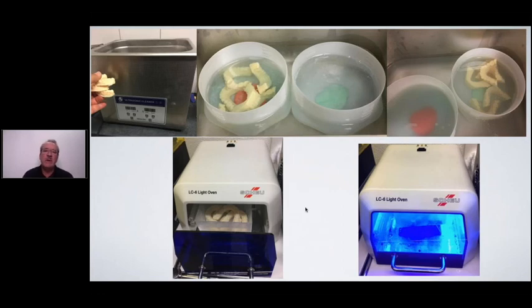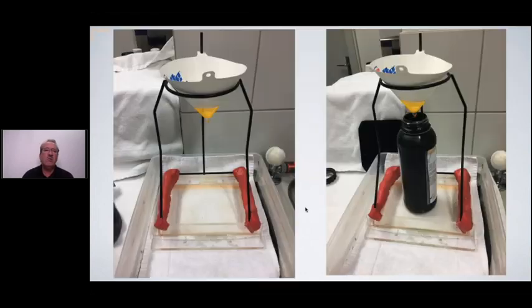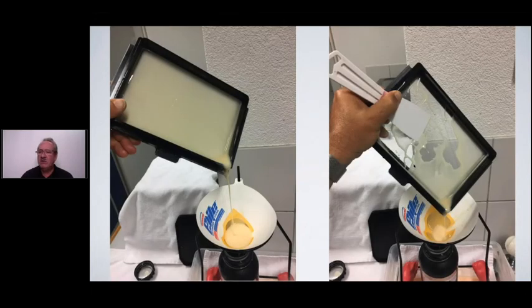With nitrogen, we get a better and harder surface on our things. After printing, we usually put the liquid back through a strainer, like you see, and put it back in the bottle, because we don't want any floating parts in our liquid, because liquid is kind of precious. We've figured out that a printed model works out to about €8. So this way, we put it back into the thing here.